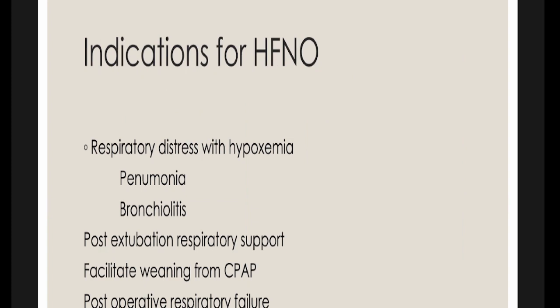So the indications for high flow are respiratory distress or hypoxemia, where a patient only needs a higher percentage of oxygen, like in pneumonia, bronchiolitis, bronchiectasis. And also during post extubation, sometimes there are patients who need a bit of oxygen support and ventilator support, but do not necessarily need to be intubated. In that situation, just to bridge the therapy until they recover into a Venturi face mask or a conventional oxygen face mask, we can use the high flow nasal oxygen.